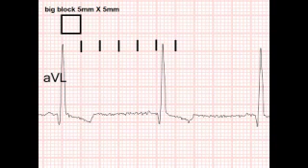What we want to do is look at the EKG, which is printed on EKG paper. EKG paper is like a grid paper. It's got little tiny blocks on it, and it's got slightly larger blocks. Each one of those slightly larger blocks, we call those big blocks, are 5 millimeters by 5 millimeters. The key to determine a patient's heart rate using just an EKG strip on a regular rhythm is to identify the number of big blocks that occur in one R to R interval.